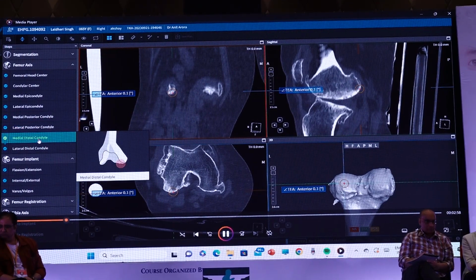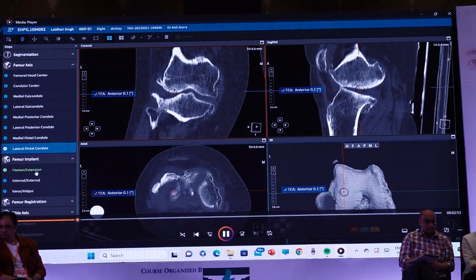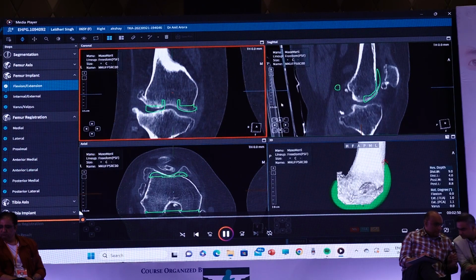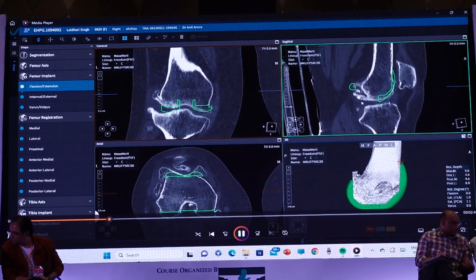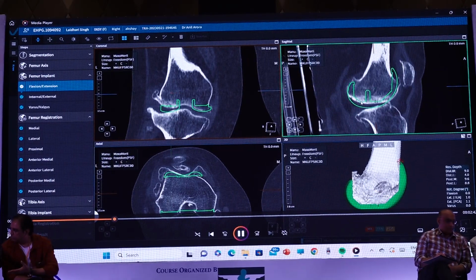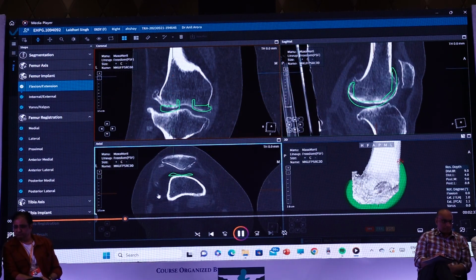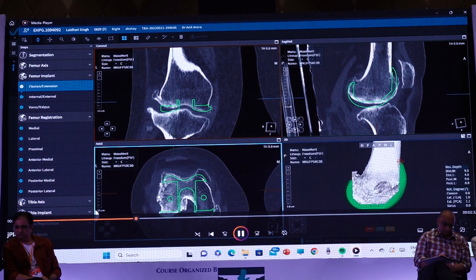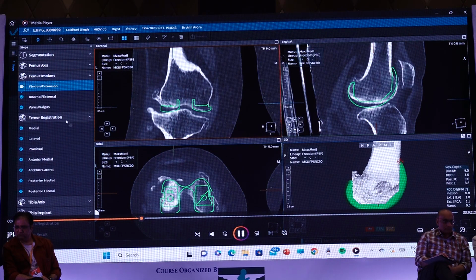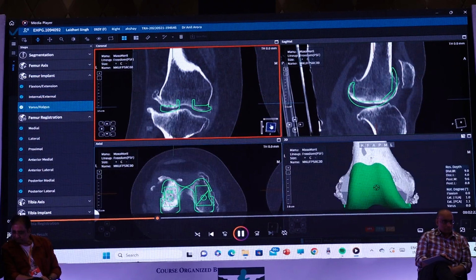And various bony points, medial distal condyle, lateral distal condyle. There was no notching. The size seems to be adequate in AP as well as medial lateral dimension. This was size C. So still we have some margin. We can still, if required, posteriorize the component. We kept it 1 degree external rotation to surgical trans-epicondylar axis.